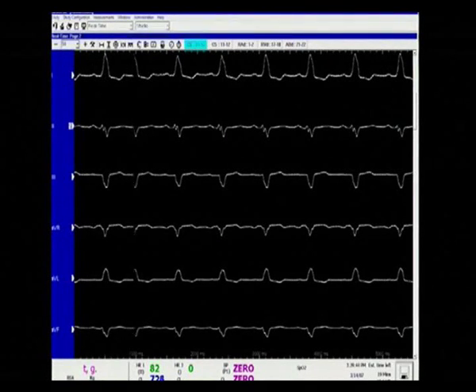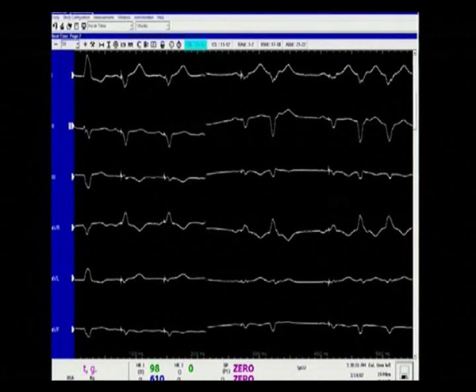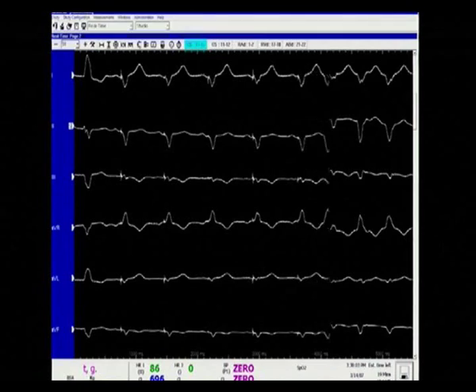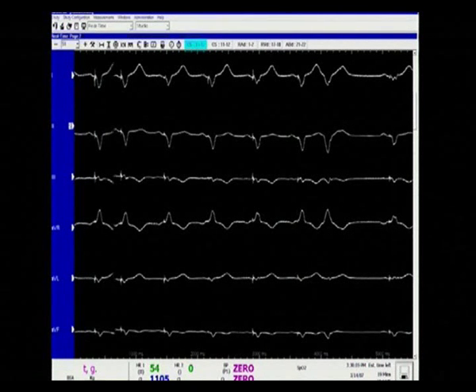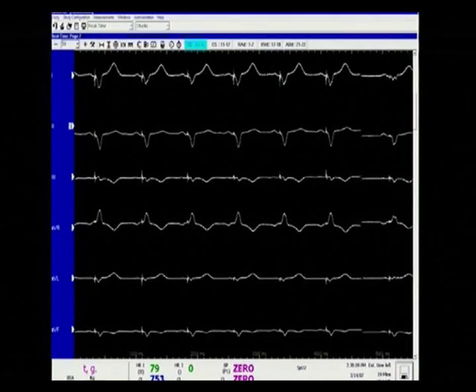The lead is then advanced over the guide wire to reach its tip at the apex of the lateral branch. The baseline six limb leads are shown. Next, we start stimulating from the target coronary sinus lateral side branch. The left lateral pacing results in Q waves in lead 1. The pacing position appears to be stable, allowing us to obtain PV loop parameters.